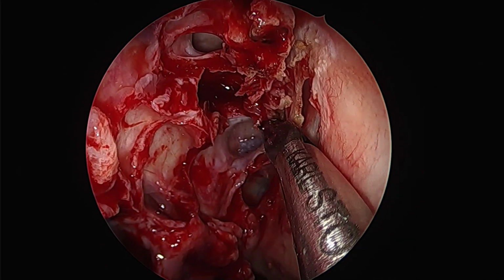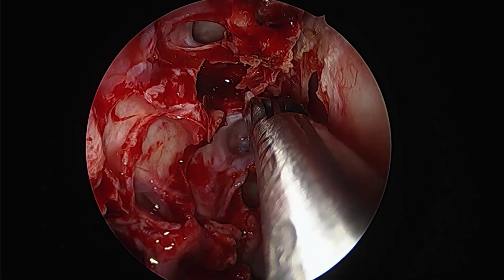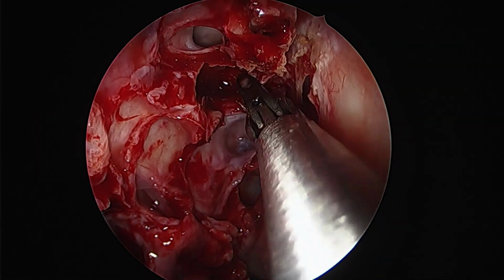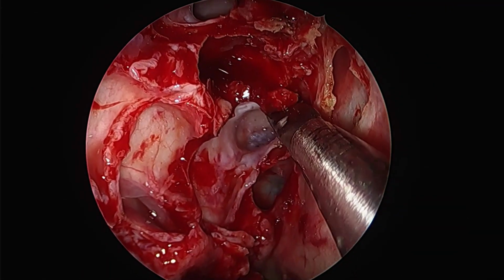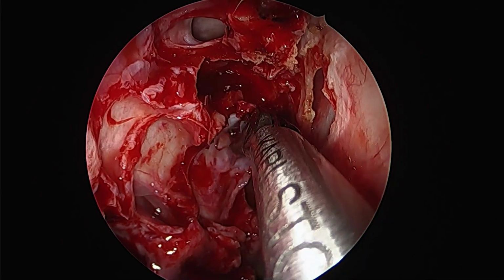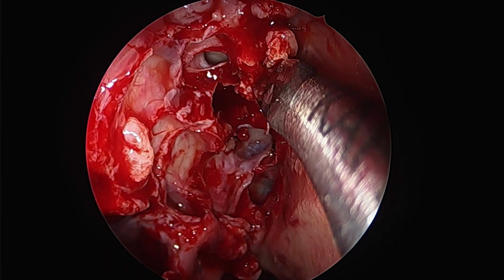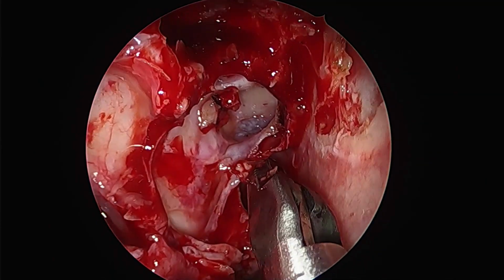Now this surgery is done under navigation guidance. It is not compulsory, but it just adds one more tool, and sometimes post ablation or coagulation the CSF leak may become obscured, and finding the same may not be very easy, and just the presence of intraoperative navigation adds a double layer of security towards the surgical outcomes.